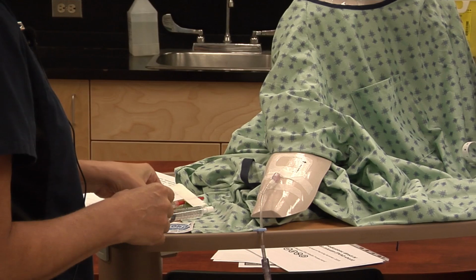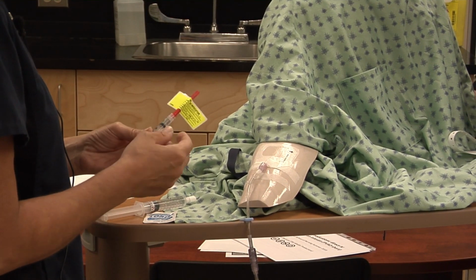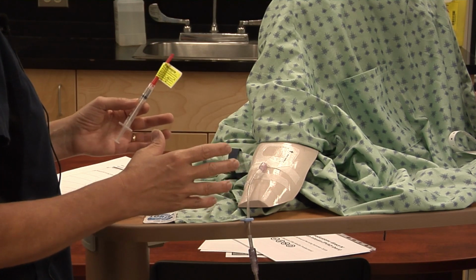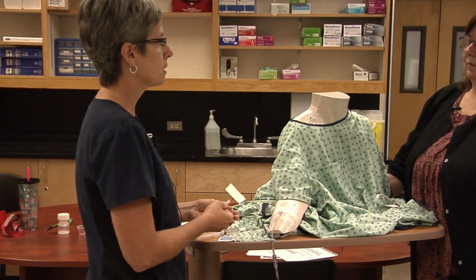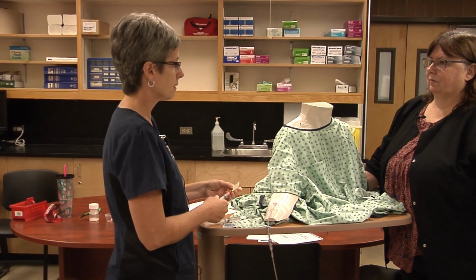So first thing I want to think about is, when I prepared my drug, I had to look at the drug monograph. In our health authority, we have a parenteral practices manual, which gives us all kinds of great information about what the drug is, what the common side effects are, how we can give this drug IV. Do we push it or give it direct? Do we put it in a mini bag? What kind of volume? What kinds of things do we need to look out for? How fast can we give it? So in this case, I am giving morphine. I can give it over 2 minutes. And I've had to look at compatibilities too.